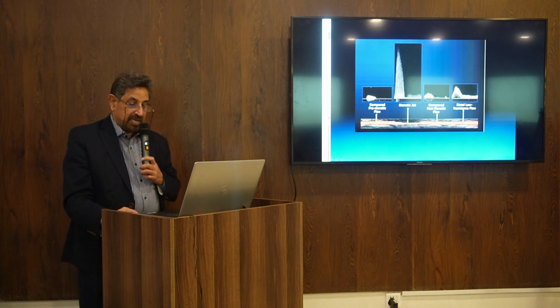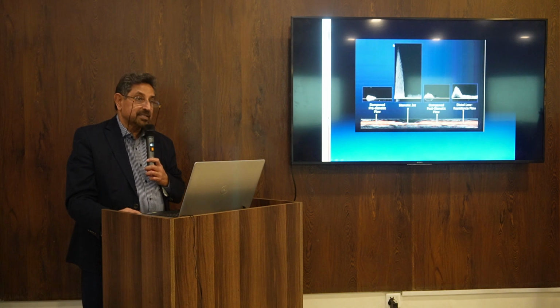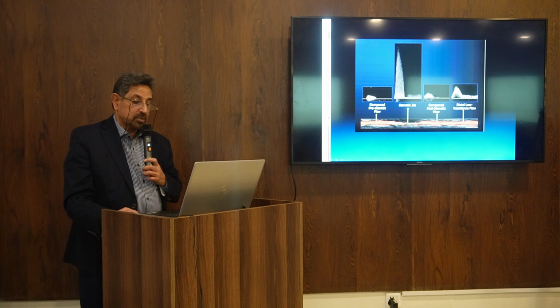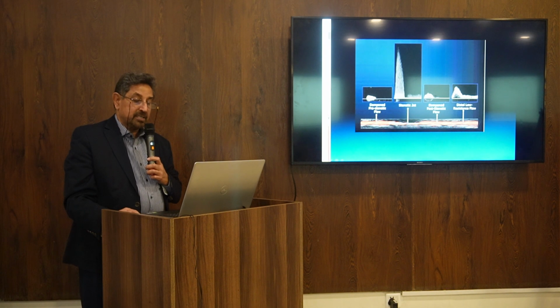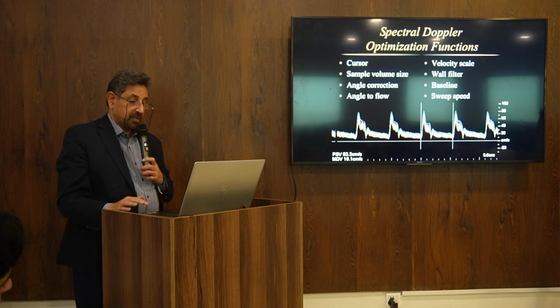But you see the rising time? The peak is not like this. The peak is going slowly upward, and that is called tardus parvus. Because after a stenosis, the speed is not going up that rapidly. That is the basis of diagnosis.